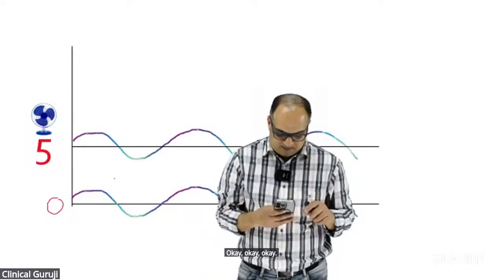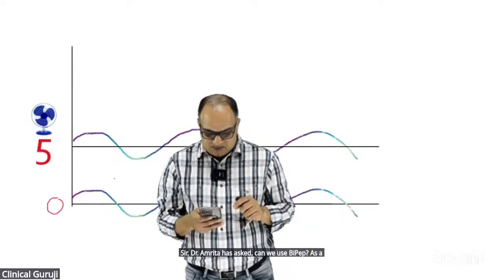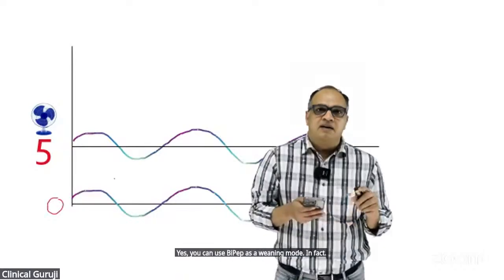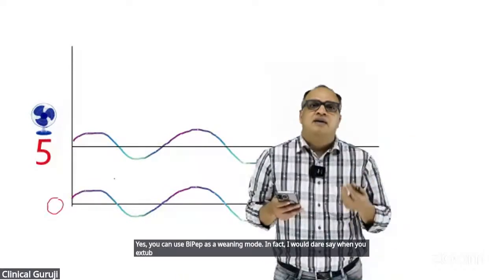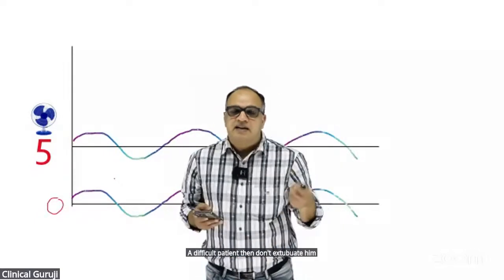Dr. Amruta has asked, can we use BiPAP as a weaning mode? Yes, you can use BiPAP as a weaning mode. In fact, I would dare say that when you extubate a difficult patient, then don't extubate him directly to room air. Instead, extubate him to BiPAP.